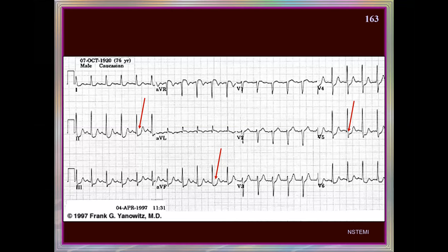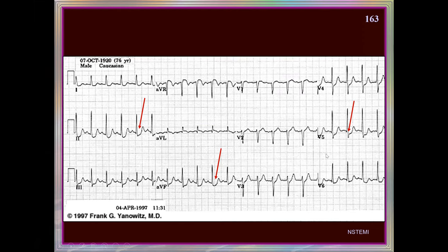Looking at this ECG, what is striking? The heart rate is around 130 — there is tachycardia. The axis is normal. We don't see big P wave changes, no LVH or RVH. But we are seeing typical ST segment changes — horizontal ST depression in V5 and V6, and also in L1, to some extent in L2 and AVF.